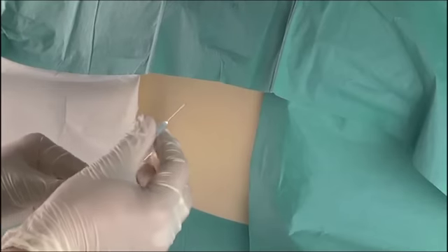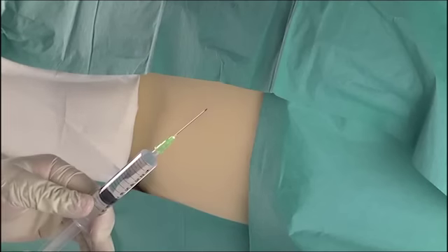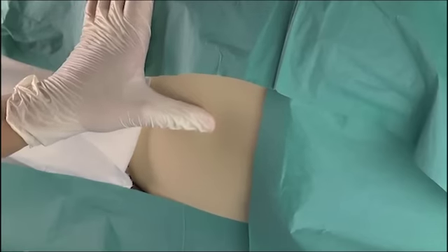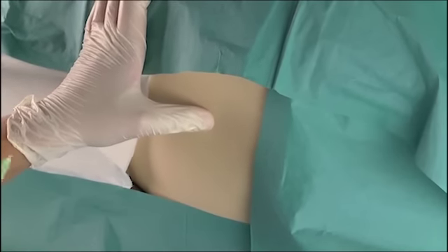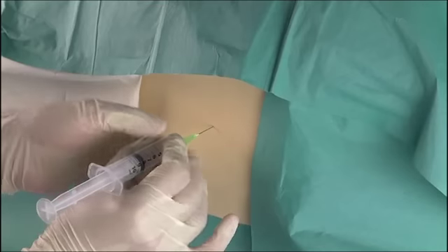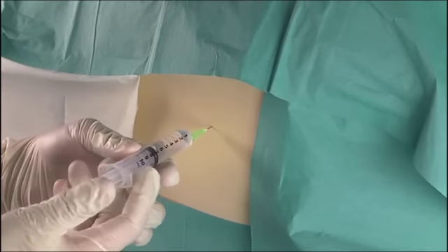Change the needle now to that of a green gauge. Again, find the position by determining the lateral and inferior aspects of the spinous process at L3-4. Again, insert the needle horizontally and withdraw to determine that there is no blood within the syringe before instillation of the lidocaine.